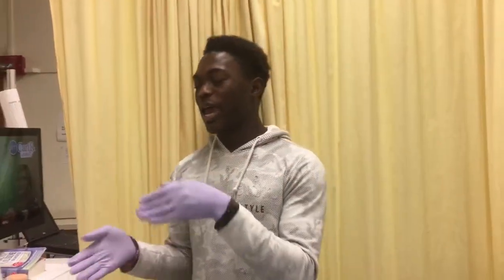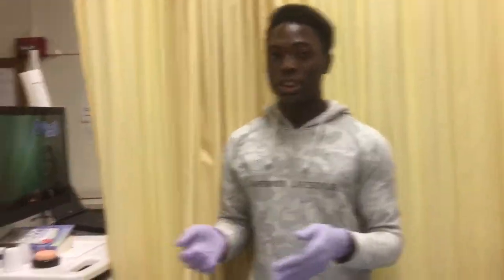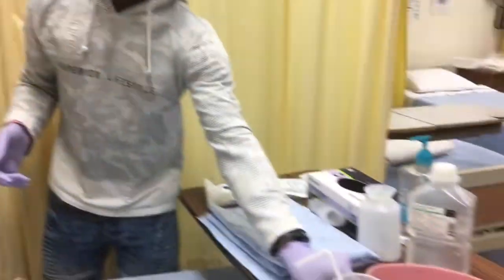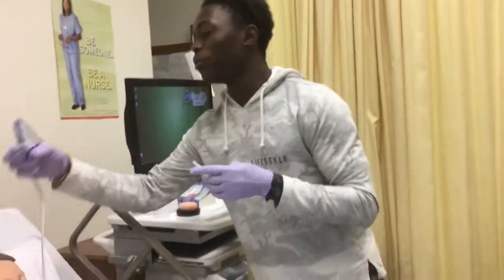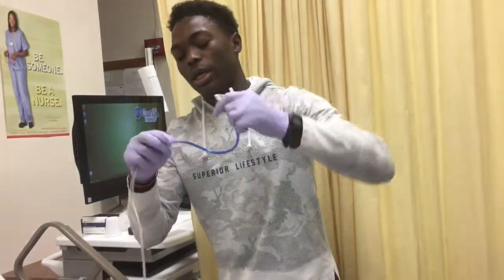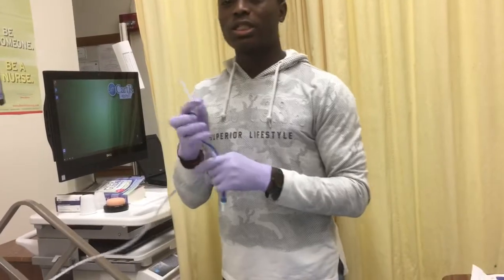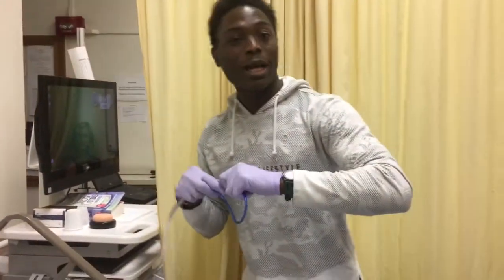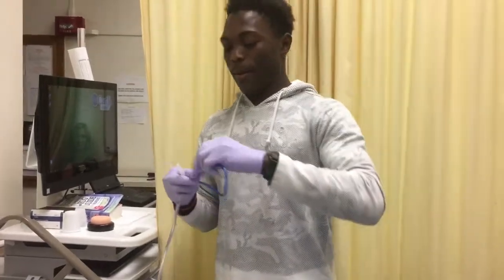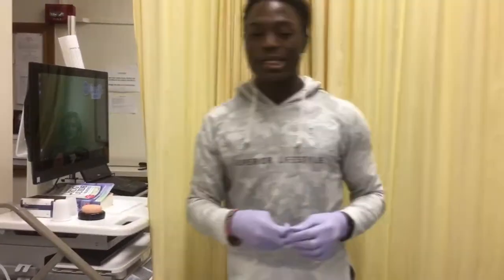In the situation that I have to do suctioning on the patient, you're going to come back in and do the same standard procedures, and you're going to use your suctioning tube, which is right here in this video. You're going to remove this support, put this in here, connect your suction kit to it, and you can do your suctioning. But I'm not going to do suctioning in this video. Okay, so this is how you insert an NG tube.